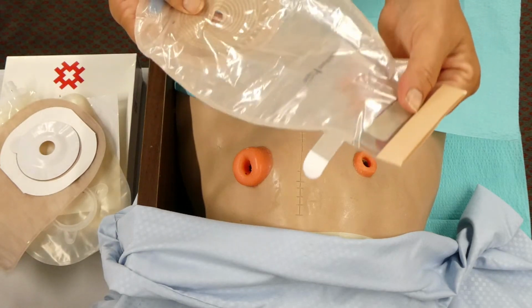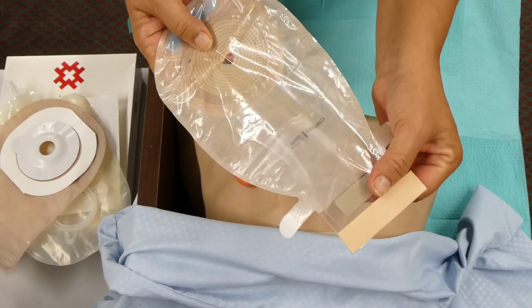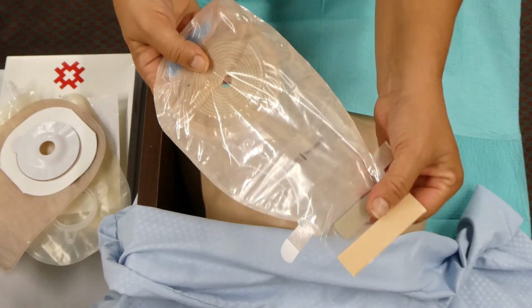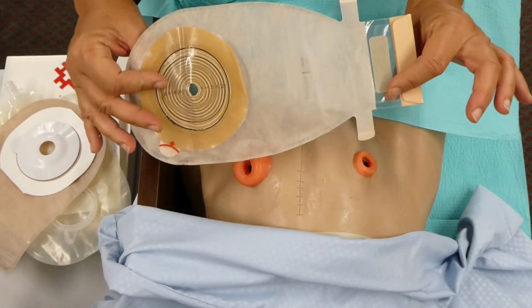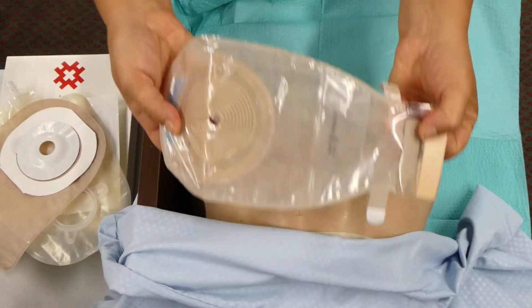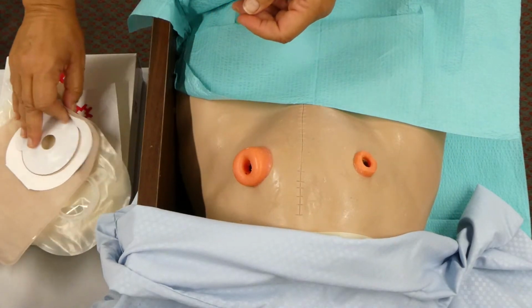Now, some bags are meant to empty and reuse. Sometimes Medicaid or Medicare will pay for only one bag a day or one bag every 3 days. You need to be aware of that so that you know you're not going to be using more than you have the ability to have for that patient.